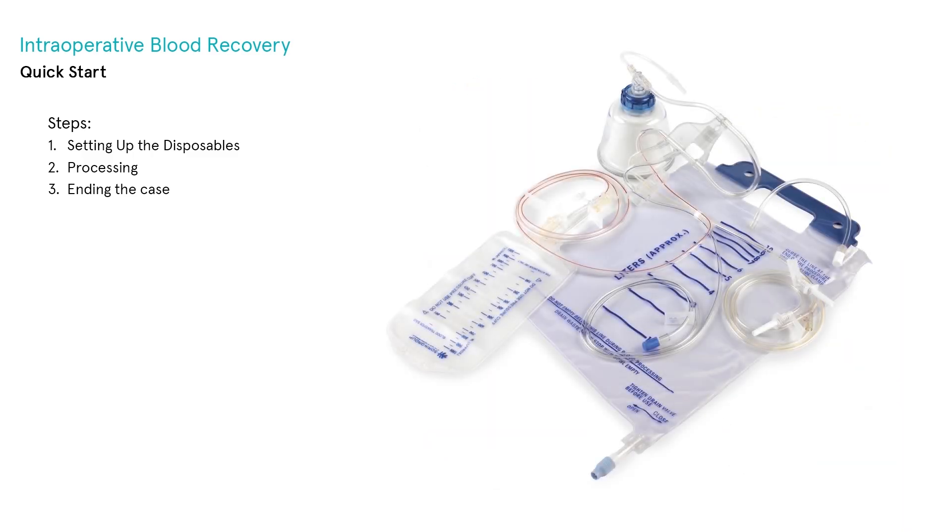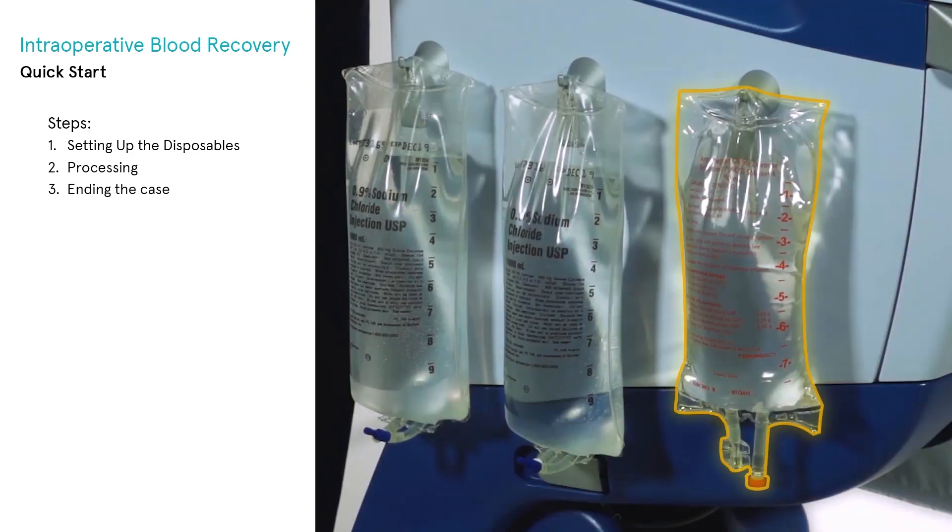A bowl set, which includes a centrifuge bowl in the selected size, a tubing harness with pump-loop cartridge, a 10-liter waste bag, and a 1-liter primary RBC bag. Also required are a bag of anticoagulant solution and a bag of wash solution.